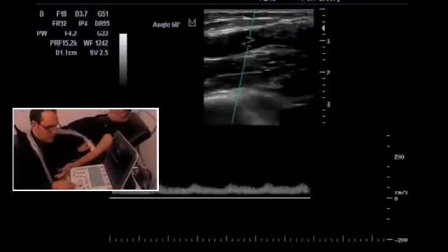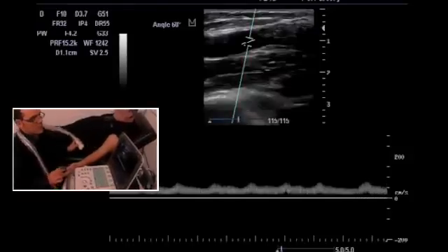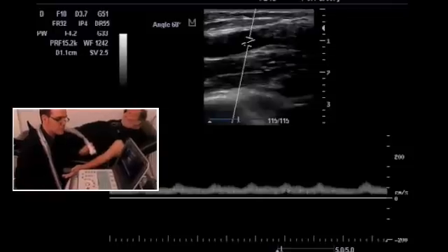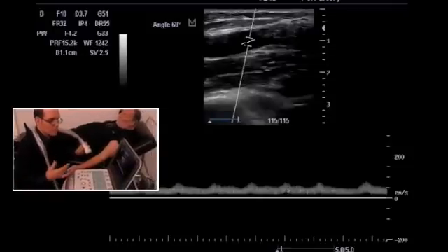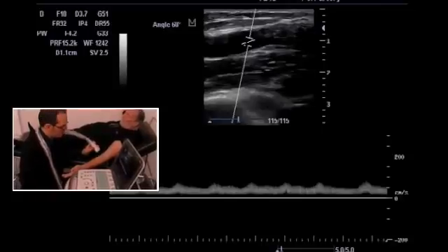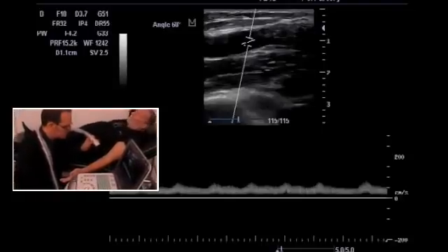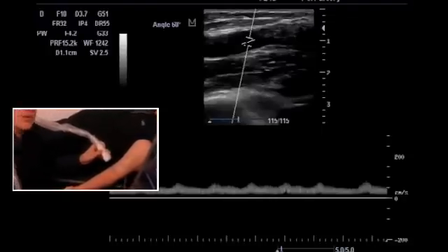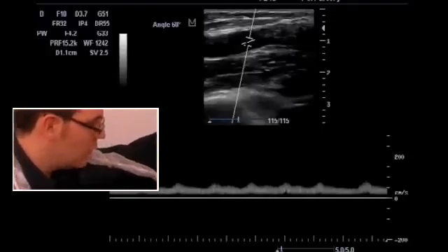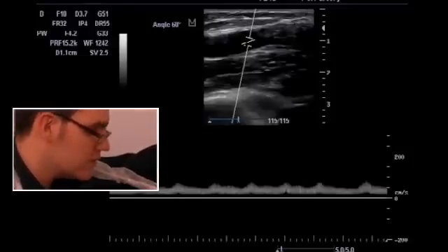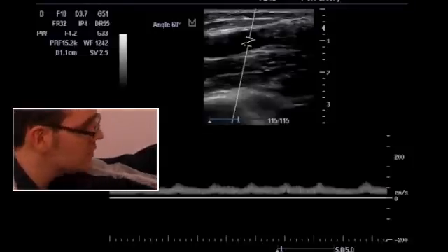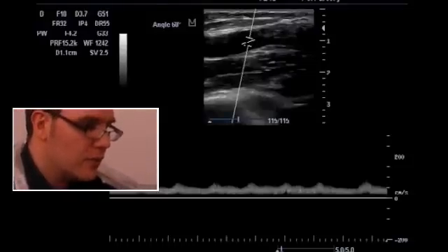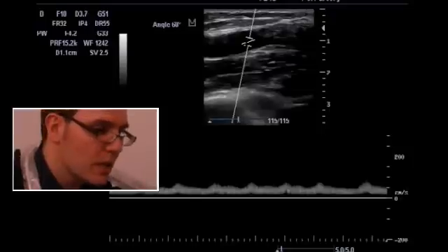You see very clearly a flow of maybe 100, maximum 100 centimeters per second. We saw at least a doubling of the flow at the post-anastomotic region. Together with the fact that we saw over the last three to four months a decrease in volume flow through the fistula from one liter per minute to 500–600 milliliters per minute, this is an extra argument that something is wrong with the fistula and that further workup is needed by angiography.